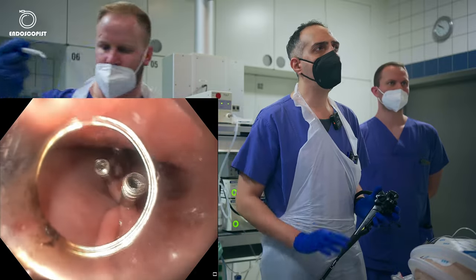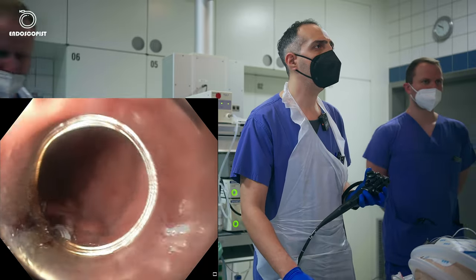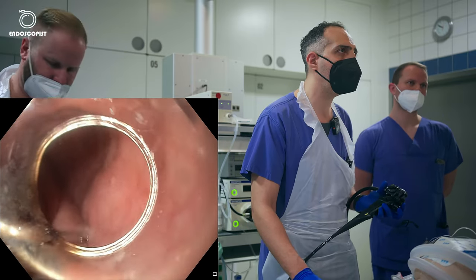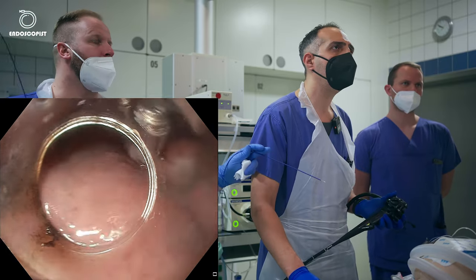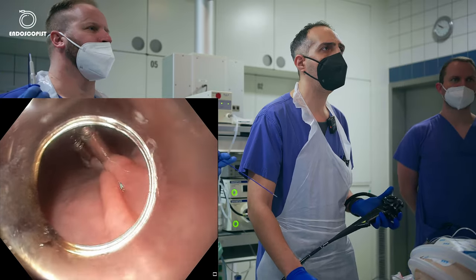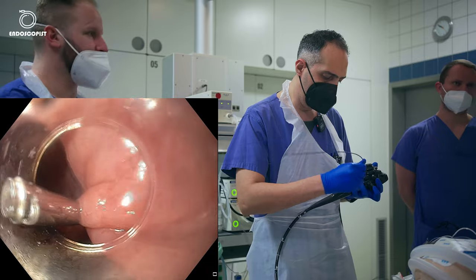So it's completely closed now. I put another clip just to be sure that everything is fine. You have to go from the left or the right edge first to see that the clips are holding the fold, and then I will go from the other side, and as you can see here, it looks very, very fine. So I'll put a clip upwards and maybe another clip here just to make more tension on the edges.